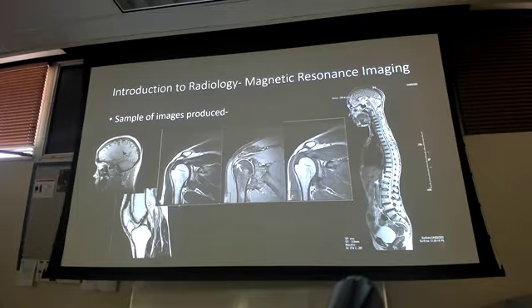But without the colors, just look at the detail of the soft tissue and the different areas of the body and how it looks different from CT. The best way to figure this out is when you're doing your studying, pull up that slide that has both of them, or pull up, we have plenty of slides in the slideshow of a CT of that area or an MRI of that body part and look at the difference side by side, right? Train your brain to see the difference on that.